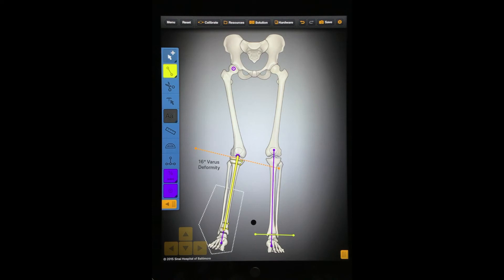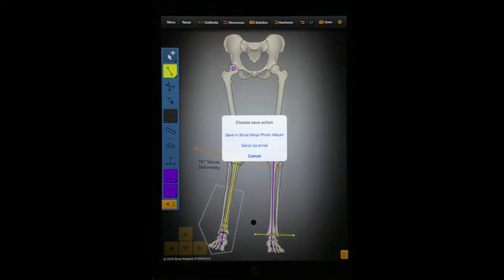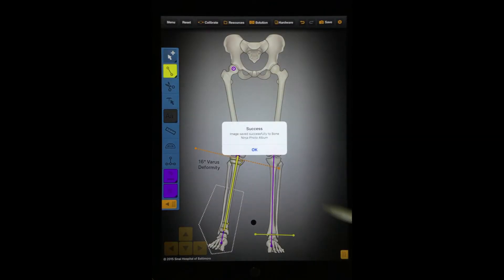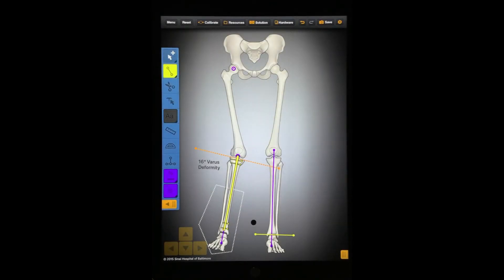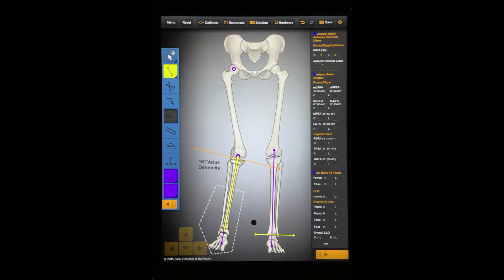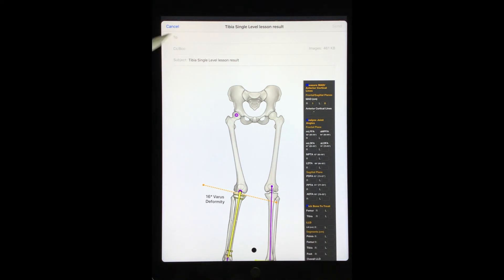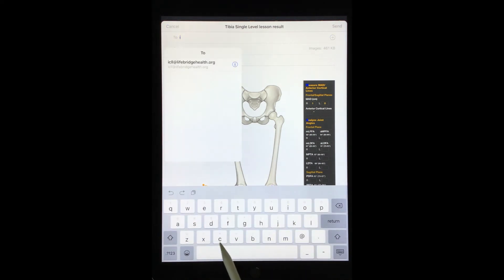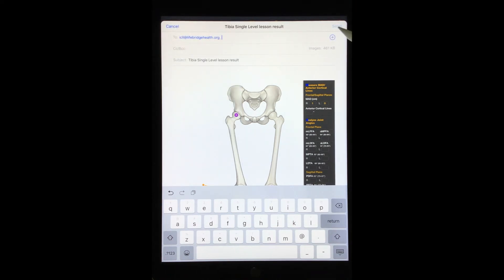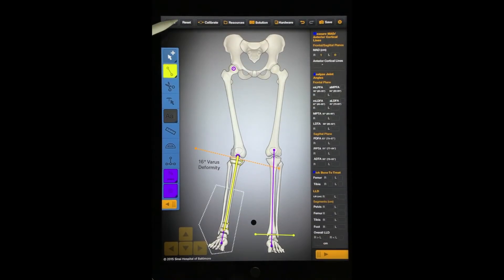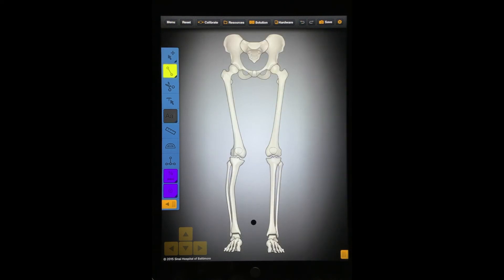Let's look at the Save tool. Press this button to save your case by emailing it or by saving it as a JPEG in the Bone Ninja photo album. When you press the Send via email option, your email program will launch and the image will be included as an attachment along with any annotations made in the standard measurements grid. Press the Reset button to clear all your work — arrows, cutouts, angles — and return to the clean, original X-ray.